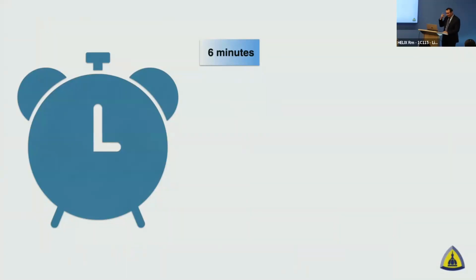So I scratched my head over this, and then on a whim, I decided to increase it to 10 minutes. And then, completely opposite, now I'm getting beautiful results. So for our scenario, the way we do our acquisitions, it seems like 6 minutes was okay for some patients, but not good for most patients. And 10 minutes has been good for most patients.